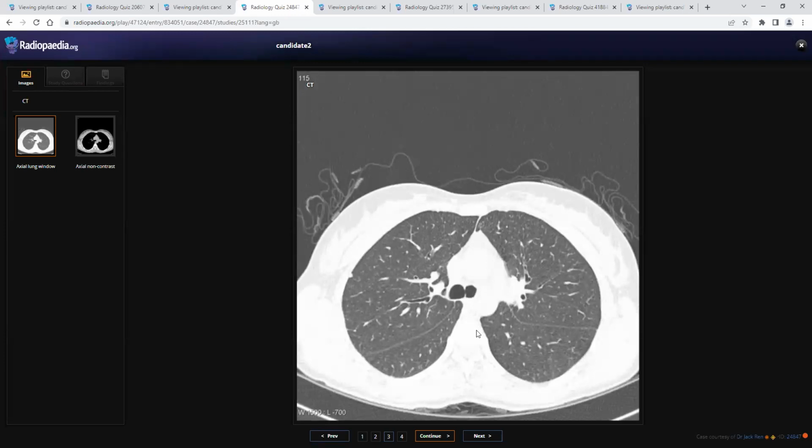Okay, so for subpleural nodule, I can say it can be part of sarcoidosis, or can be part of lymphangitis carcinomatosa, or can be part of Langerhans histiocytosis. Which of them cause pneumothorax? LCH. Are you sure? LCH causes pneumothorax, LAM causes pneumothorax, but LAM shows no nodules, just thin-walled cysts. Yeah, we will come back to this case again.